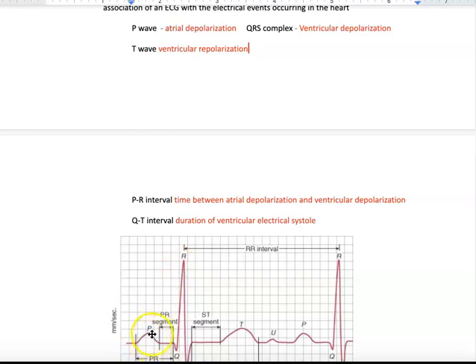So this P wave here, this represents the atrium depolarizing. Again, go back to your nervous system action potential. So the atrium cells are depolarizing, they are contracting. You get the movement of ions, we see this little generation of electricity. You get the P wave. So you can imagine the SA node is firing here. It passes through the atrium, you get that contraction. There's this little segment here where there's no electricity being generated. This is when the impulse is going down from the internodal pathway to the AV node, down through the bundle branches. There's a delay there.